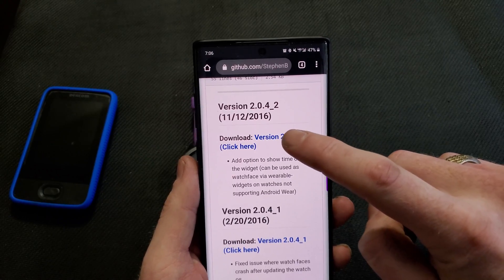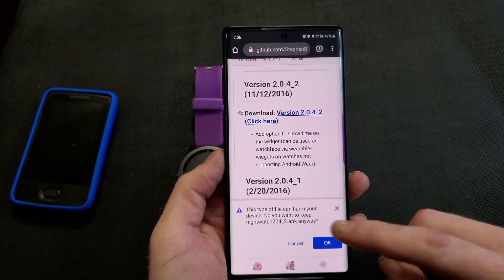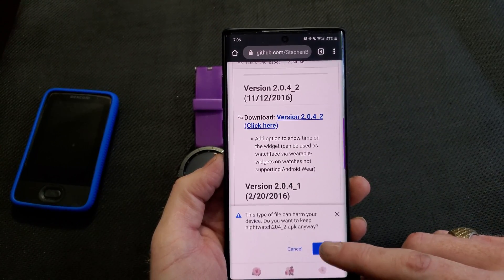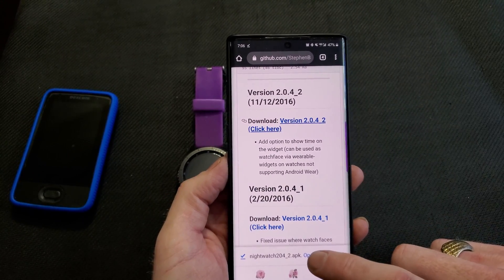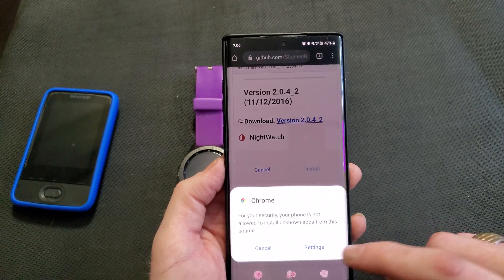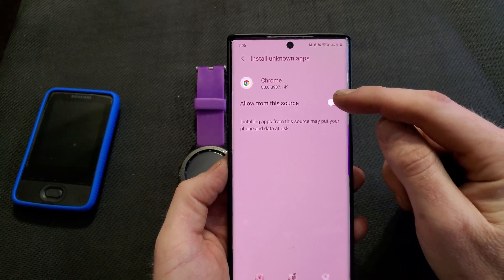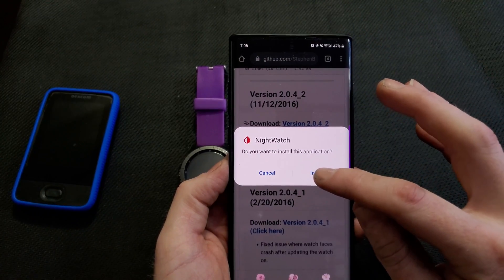So what you're going to do is click on the top one, and it's going to ask if you want to allow this to be installed from an external source. I'm going to hit yes, and then open. If it's not allowing, go to allow from this source, then install.